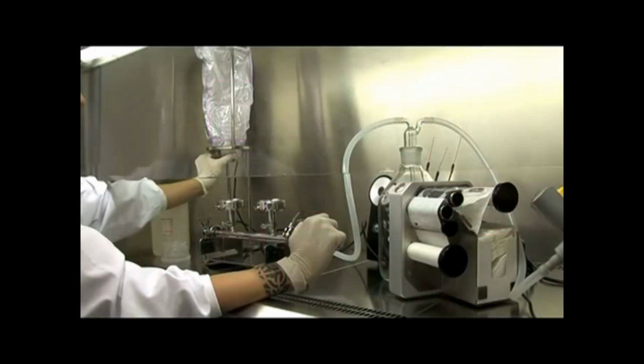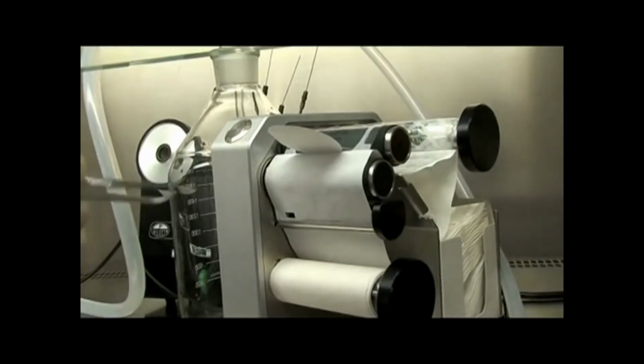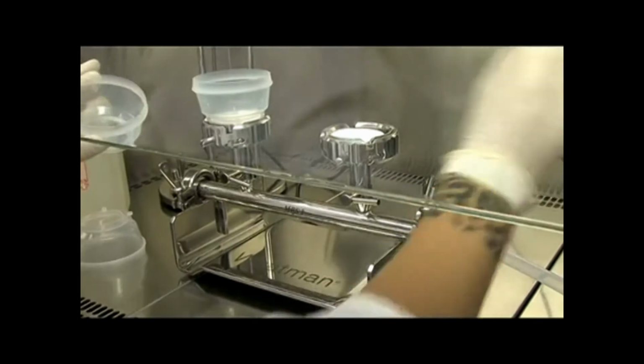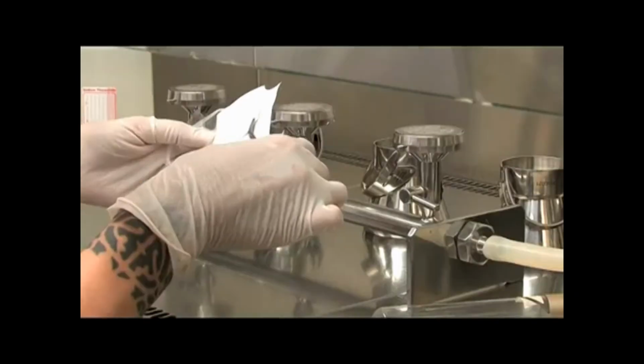The use of the membrane filtration technique is highly recommended. The water sample is filtered through a membrane filter of 0.45 micron pore diameter, validated according to the ISO standard 7704, 1985. Use standard equipment for filtration.